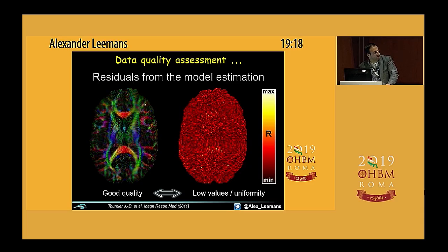You may argue, well, it's noisy. Well, we always have noise in our data, right? If you want less noise, take bigger voxels, right? But then you'll trade off resolution, right? So trade is the name of the game in MRI. So you can have high quality data, albeit noisy. The point I want to make here is that the residual map looks uniform, meaning everything which is left is basically the noise. So the residual map is now presenting you kind of everything which is kind of left over, which is in this case just the noise, assuming you have good quality data.